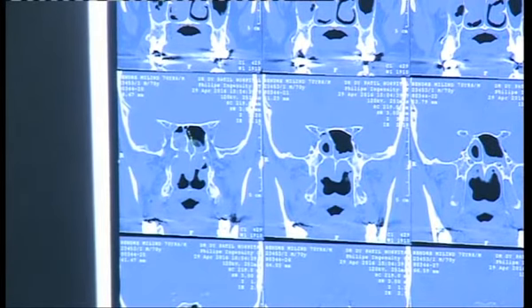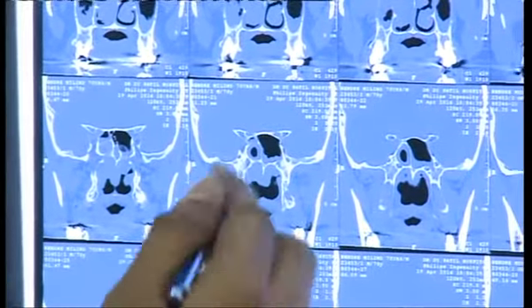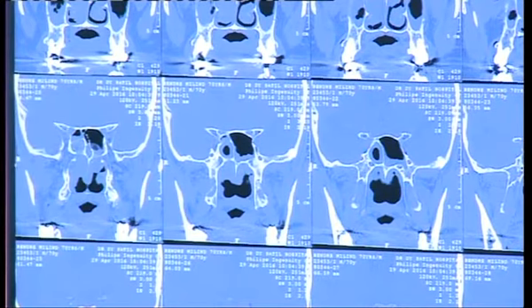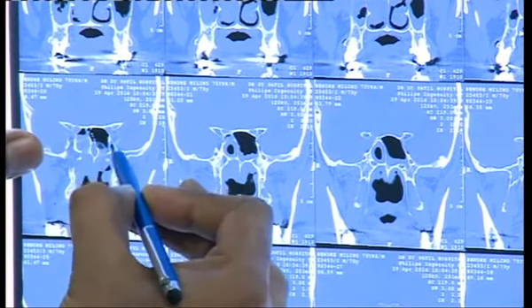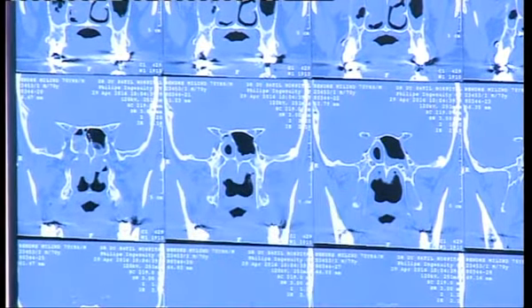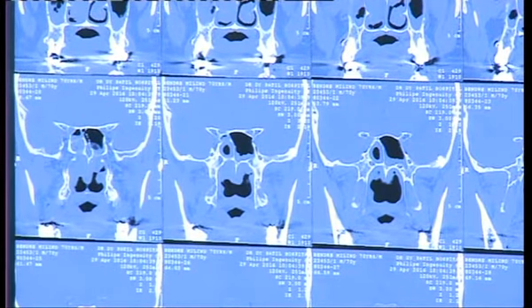Now, lastly, the patient is almost ready. Last 1 minute in the sphenoid, the clinically relevant things. Once you see the sphenoid, what we are scared of and what details we need to know are about two structures: the optic nerve and the carotid artery. Now, at this level when we enter the sphenoid, this is the orbital apex. Now going behind, see the two impressions coming into the picture. That is variable. That depends upon the thickness of the bone of the sphenoid. Sometimes the sphenoid is over-pneumatized and whatever structure is around in the sphenoid can be dehiscent. Sometimes the bone is thick, you may not appreciate it even.